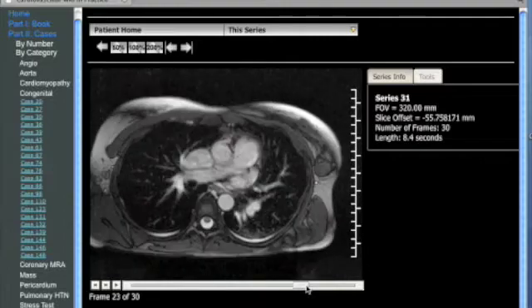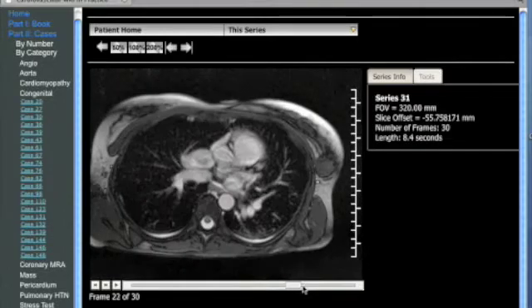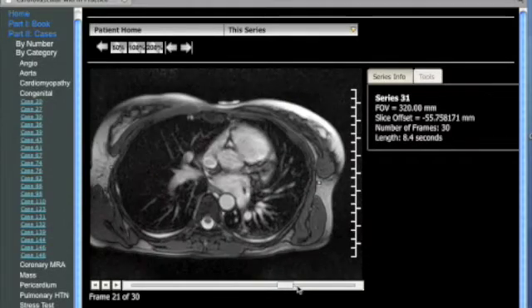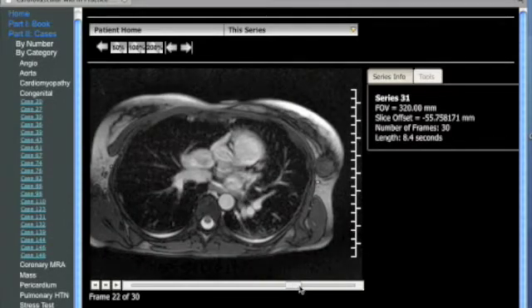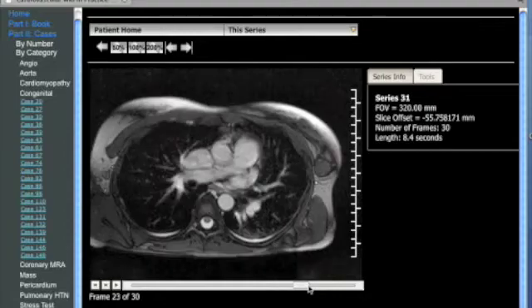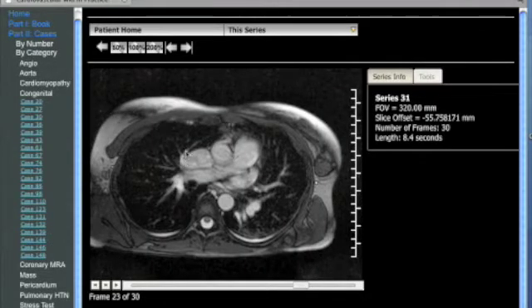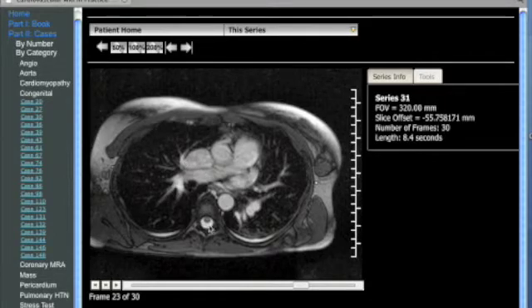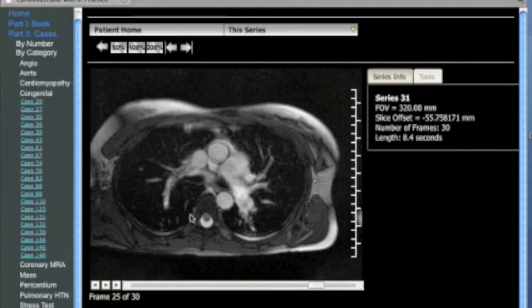No atrial septal defect was seen on detailed review of the four chamber images. On review of these images, there does appear to be an abnormal insertion of at least one of the pulmonary veins into the lateral margin of the superior vena cava, and clearly no pulmonary vein should enter into the superior vena cava.